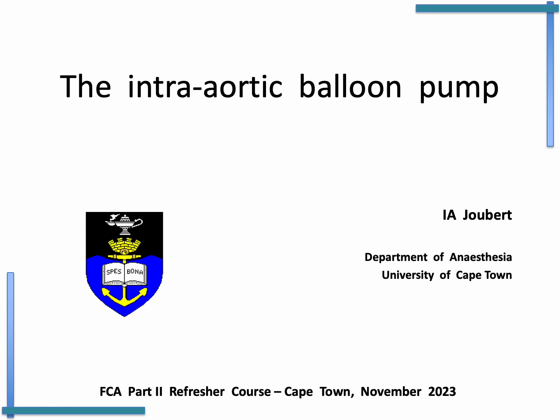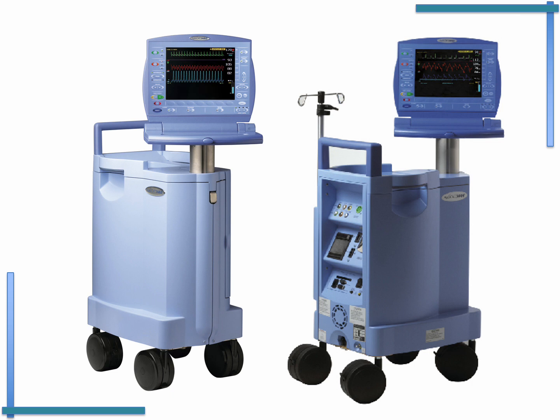Hello everyone. This presentation is going to focus on the intra-aortic balloon pump. Now, it's not infrequent that we see one of these devices connected to a patient in our cardiothoracic intensive care unit, particularly patients who are post coronary artery bypass surgery.